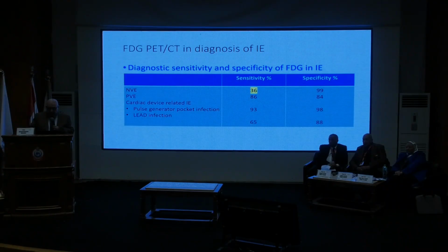Review, several studies have been done showing the sensitivity and specificity of FDG PET-CT in infective endocarditis. This is a collective sensitivity and specificity. We can see that it is very good.